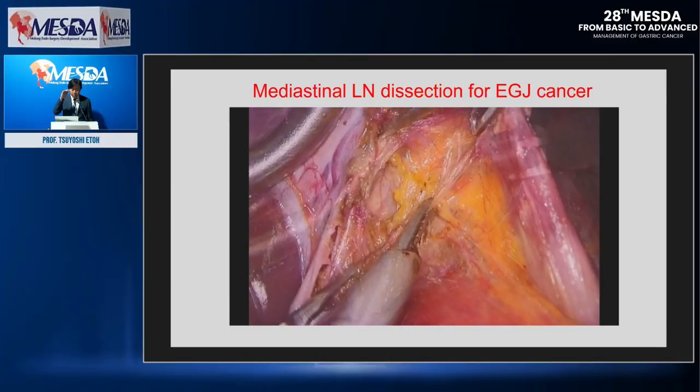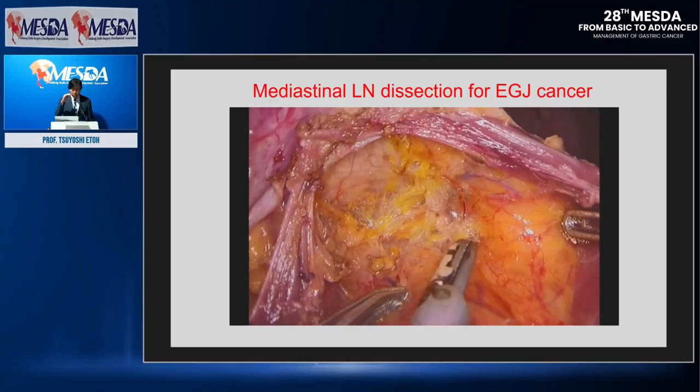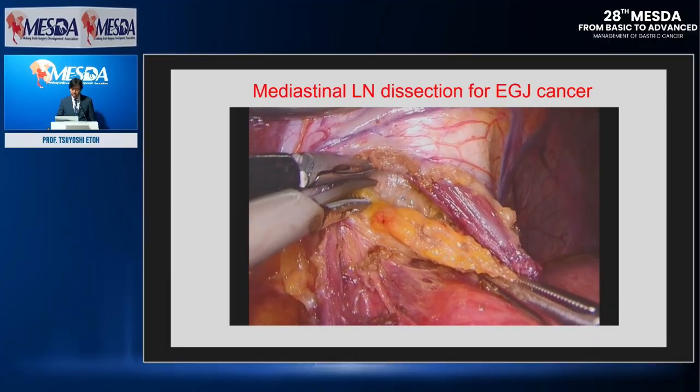And first, the upper side. I perform the lymph node dissection on the upper side, then the lower side, then the left side, and finally the right side. This is my procedure.